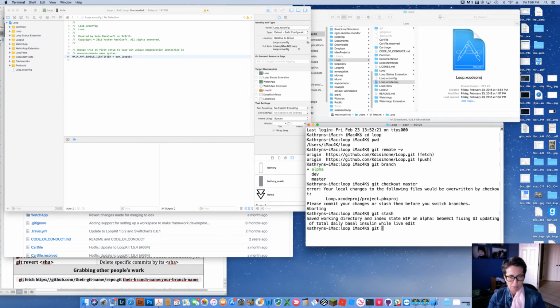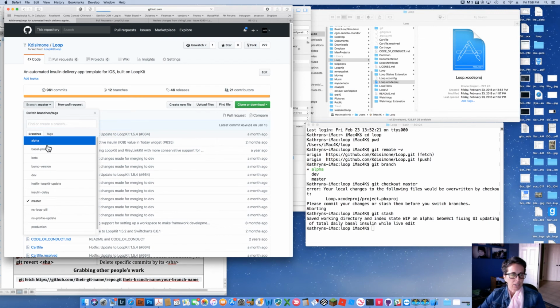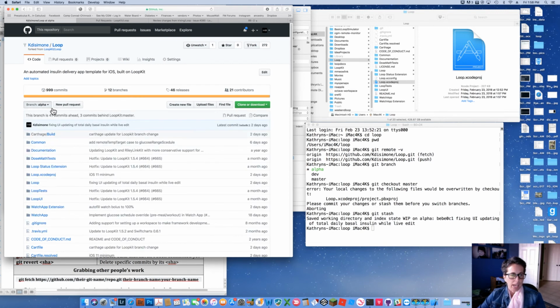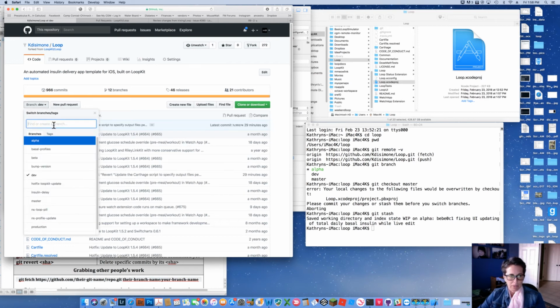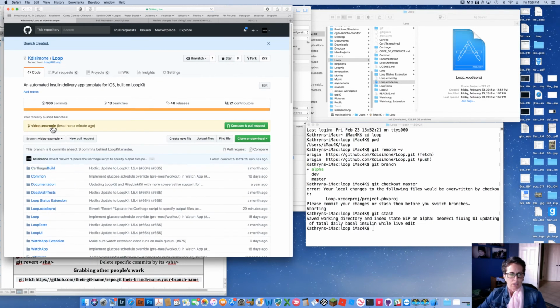So I'm still on my alpha branch. Let me change it over to my dev branch. Actually, let's do this on a whole new branch. I'm going to show you how to get a new branch going. So let's say I'm going to do a branch that is based on my dev branch. It's going to be an exact clone of my dev branch, and I'm going to call it video example. And it's going to make an exact copy of my dev branch as it is right now, but it's going to call the new branch video example.